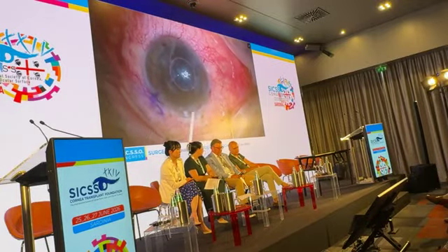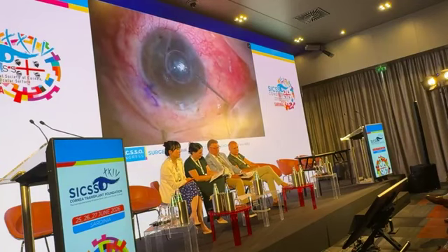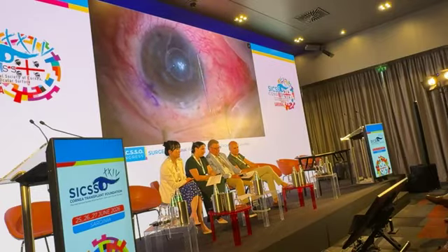Very precise surgery, so he wants to have a really good centration. More or less centered, not absolutely centered, but quite happy with the centration, so we go back to the air.